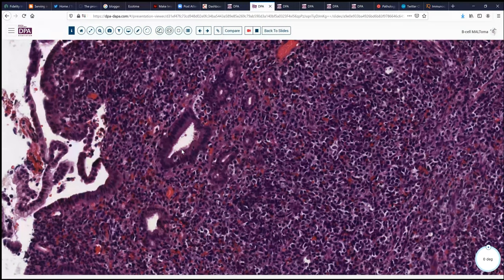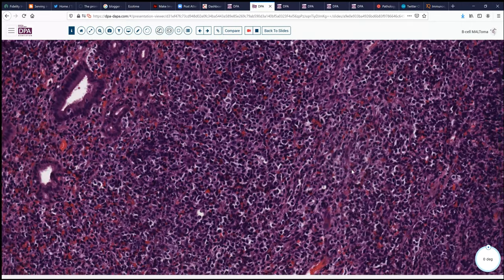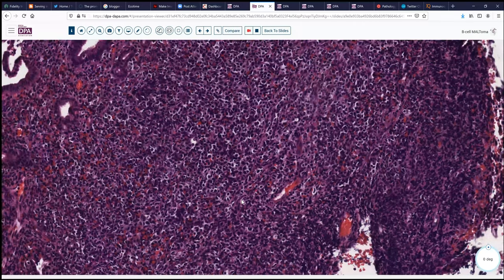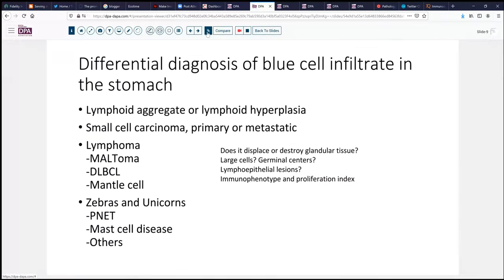So we're looking at most likely a mucosa-associated lymphoid proliferation. This raises the consideration of what we ought to be thinking about with a blue cell infiltrate within the gastric mucosa. That differential would include lymphoid aggregates or hyperplasia, small cell carcinoma both primary and metastatic — though small cell carcinomas of the stomach are exceedingly rare — and then the more common lymphoma. The majority of these will be low-grade MALTomas, but diffuse large B-cell, mantle cell, and occasionally even follicular center cell lesions can occur here. And then the more rare lesions such as primitive neuroectodermal tumor and mast cell disease.